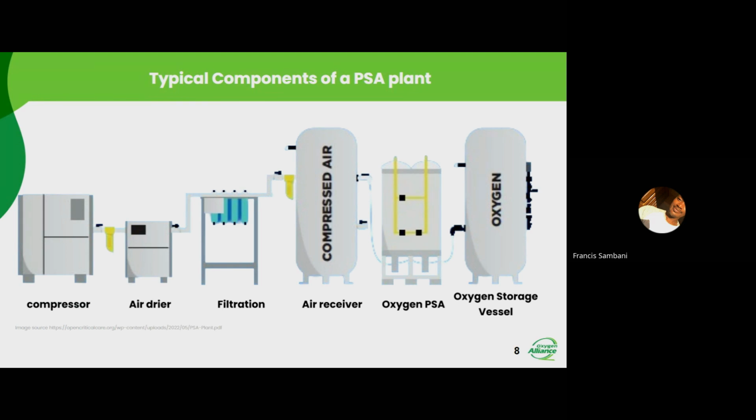In the images that I showed for Maluti, we had the air receiver just after the compressor, and I don't think that's a good arrangement. Sometimes you might need just the compressed air, because it's been filtered. Some arrangements have this compressed air going to the hospital, being used as medical air.